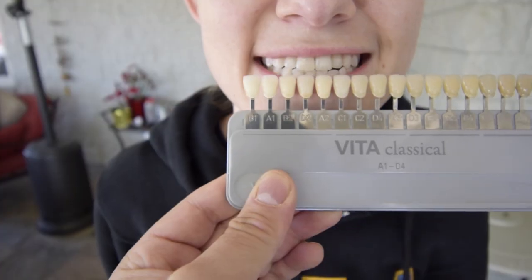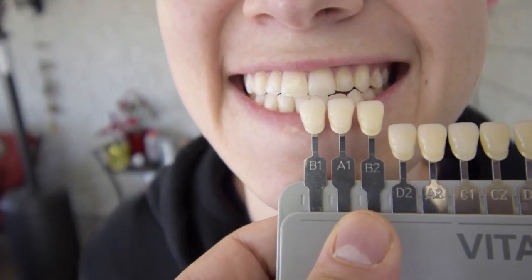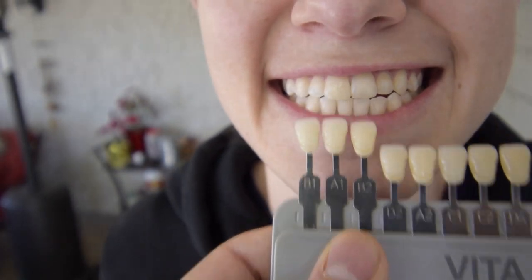Most dentists watching this video are very familiar with the classical shade guide system, and the way the system works is relatively easy. You simply place the shade tabs along the same plane as the patient's natural teeth, run it across until you find three shade tabs that are the closest match, pull out those tabs, and eliminate them one by one until you find the closest matching shade.